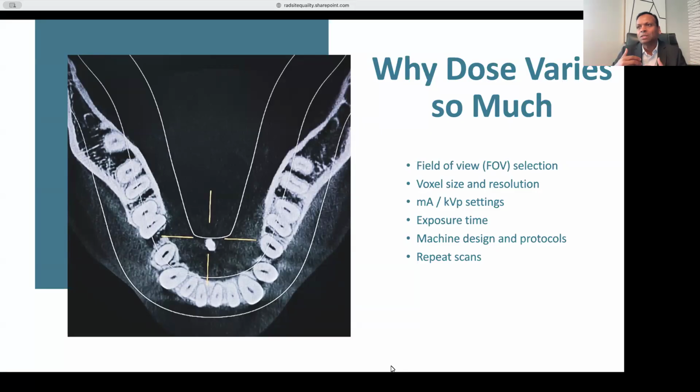Why take chances? So different states have different regulations, and obviously the hospitals and the imaging centers will be forced to follow those regulations. And there are some states that are a little dicey. They just leave it to the facilities. In such cases, I would just say, leave it to the patient. If the patient requests a shield, just give them that. There is no point in arguing or trying to explain it to them at the time of patient care. I don't think it's worth it. And especially when it comes to scanning pregnant patients, always, they should be shielded.